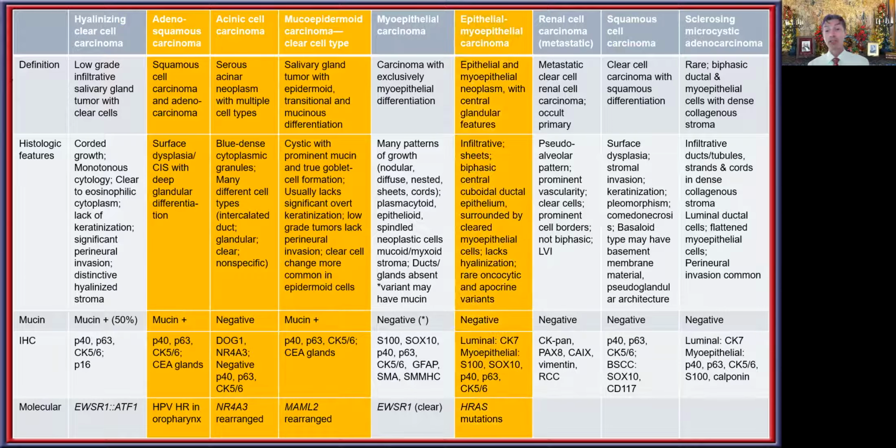When you look at the myoepithelial markers, and of course here I've selected an S100 protein just because it so nicely highlights the nerve, and yet you can see that the neoplastic cells are completely negative around it. And then a few other markers such as smooth muscle actin you can see is also negative in the neoplastic cells. The EWSR1 FISH, of course, here very nicely showing a break apart, but again, not telling you much information about the fusion partner. So let's move on at this particular point to the next tumor.